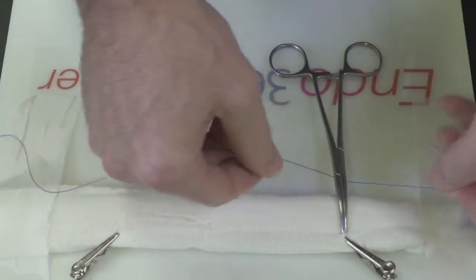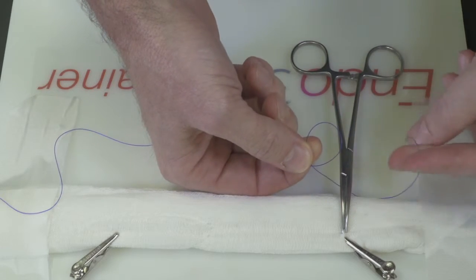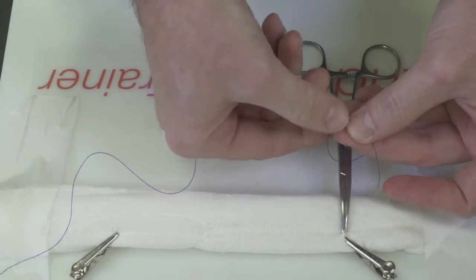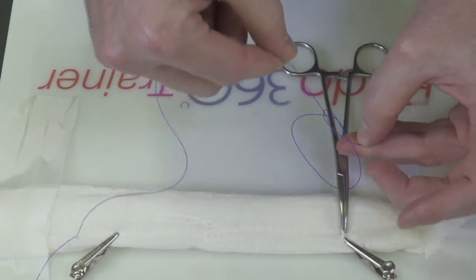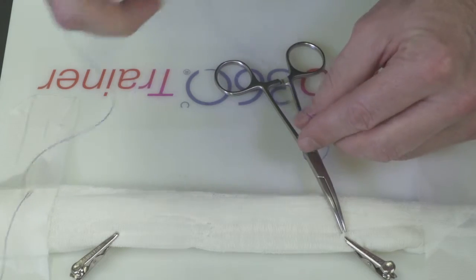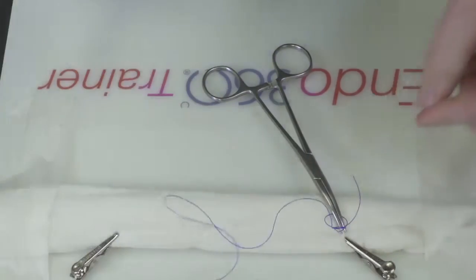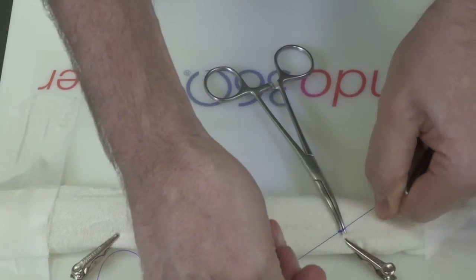Actually just create a loop out of the very end of this. I like to do what's called a Bowline knot. I was a sailor. I'm just going to create a little loop here. I come outside the loop, and then I'm going to come back around and go inside the loop. And then I'm going to tighten that. And as I tighten it, I actually want to create a tail that's probably about 2 to 4 centimeters in length. And the reason for that is that we're going to use that tail as something to actually tie to once we come around with other suture.